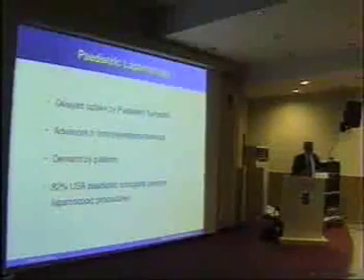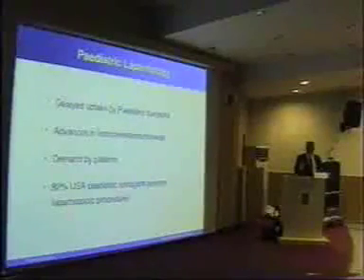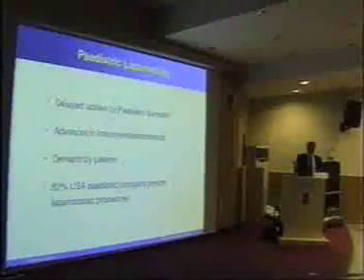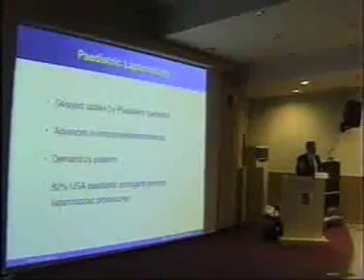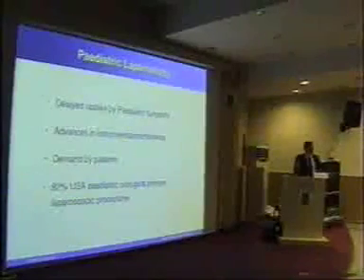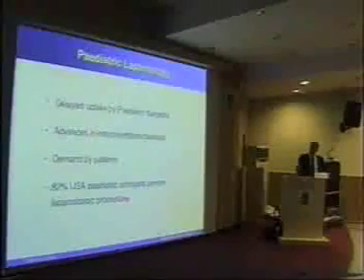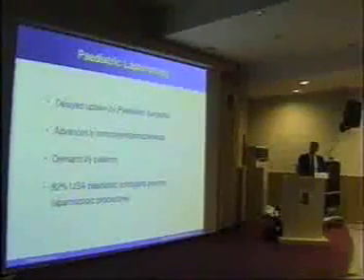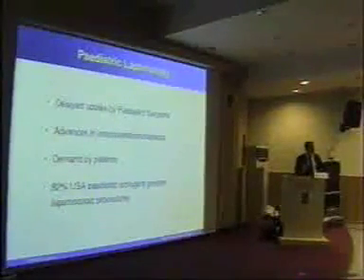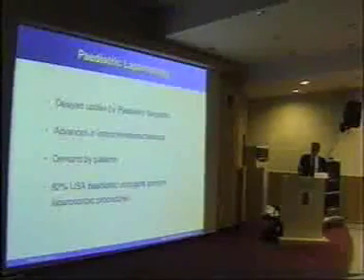Now, pediatric laparoscopy has been a little bit behind other specialties, and I know we only have one pediatric endoscopic surgeon in the audience, but nonetheless there has been a delayed uptake by pediatric surgeons of most surgical innovations. One of the reasons was the size of the instruments compared to the size of the patients. But the instruments have reduced in size, the technology has improved, and with this it's been possible to apply the majority of laparoscopic techniques to the child or to the smaller patient, even to the two or three day old baby.